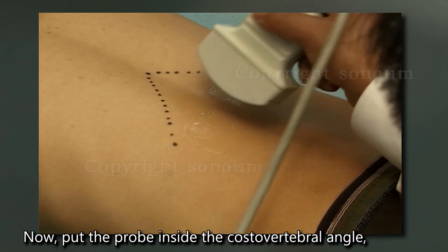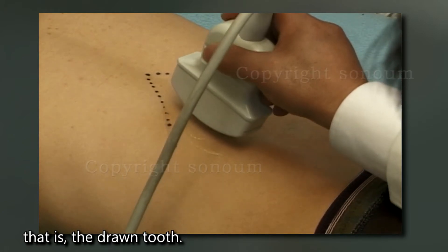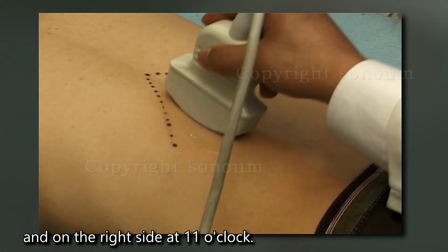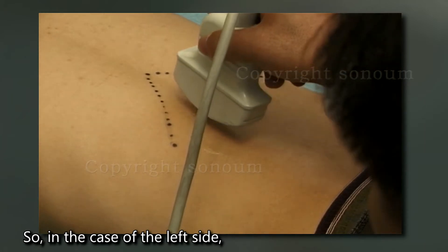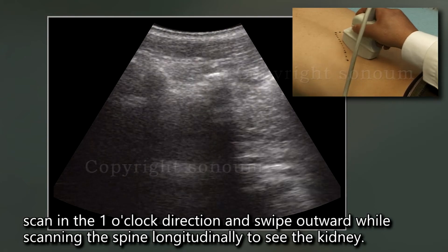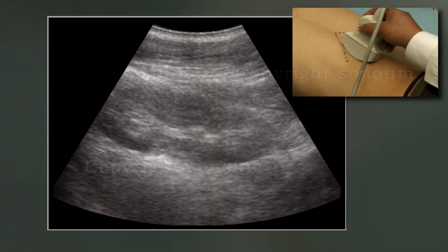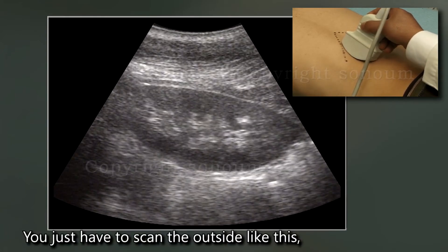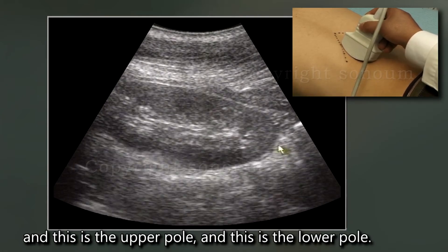Put the probe inside the costovertebral angle. If it is on the left, scan the direction of the probe at 1 o'clock, and on the right side, at 11 o'clock. In the case of the left side, scan in the 1 o'clock direction and swipe outward while scanning the spine longitudinally to see the kidney. Swipe outward once again — scan the outside like this. This is the upper pole and this is the lower pole.